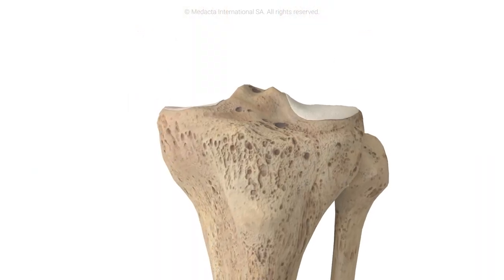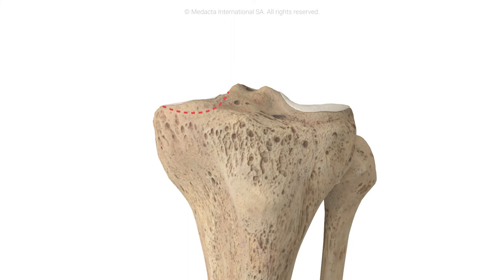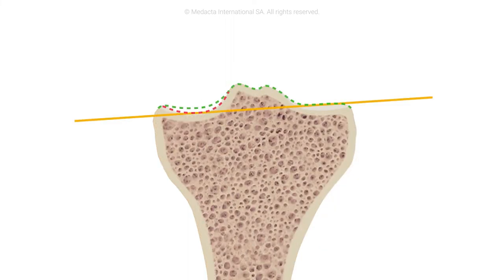The same technique is then applied to the tibia. Cartilage wear is compensated on the worn side to align the component to the native joint line.